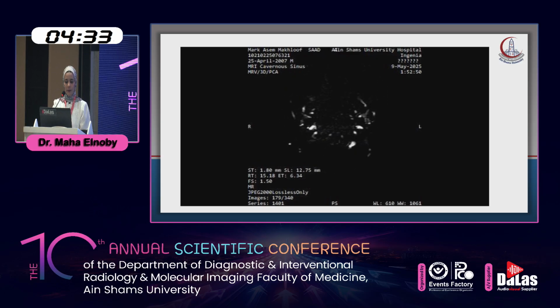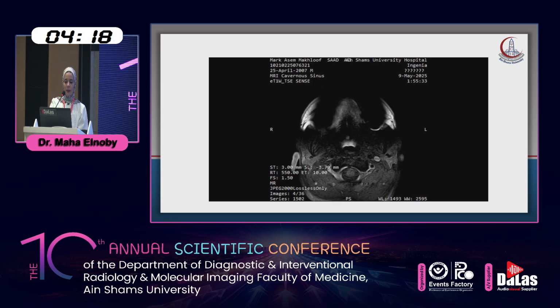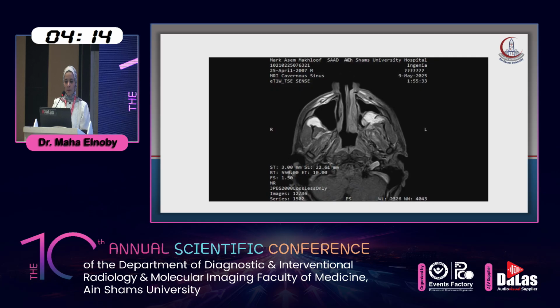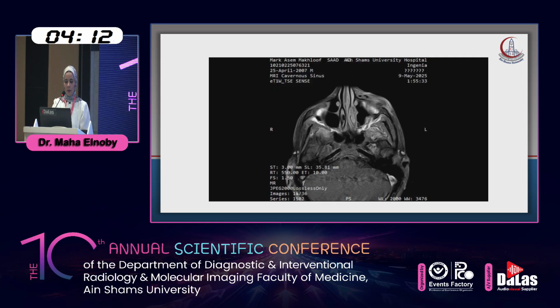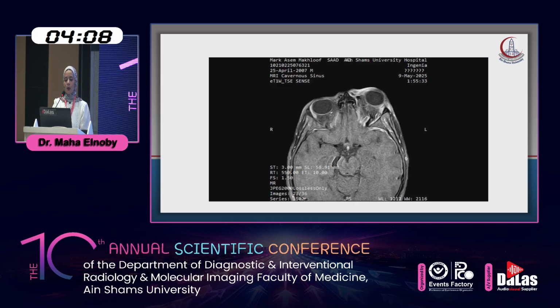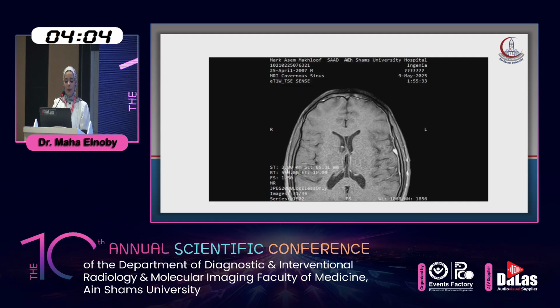MRV was done. Dilated left superior ophthalmic vein. T1 with contrast showing preserved contrast enhancement of the cavernous sinus, dilatation of the superior ophthalmic vein, and multiple signal voids within the cavernous sinus.